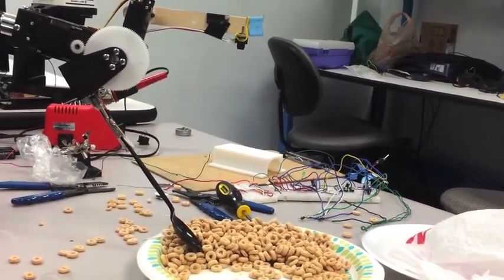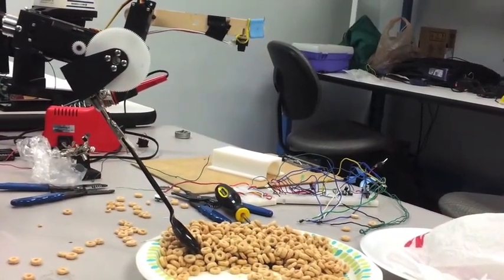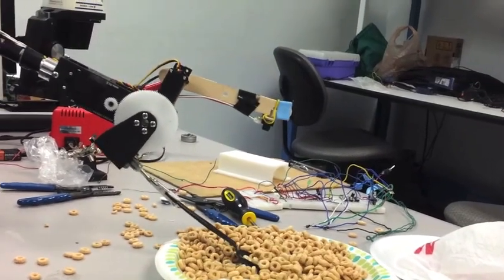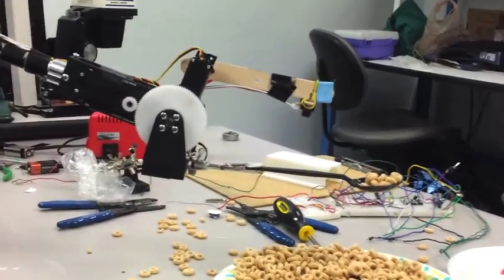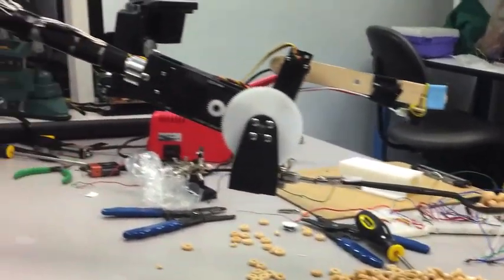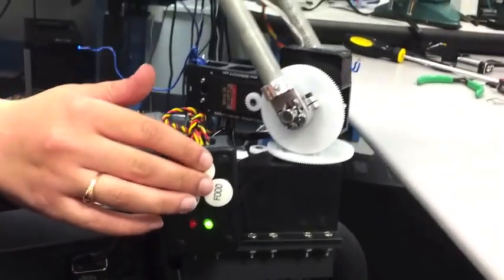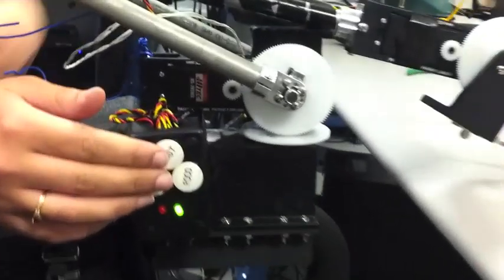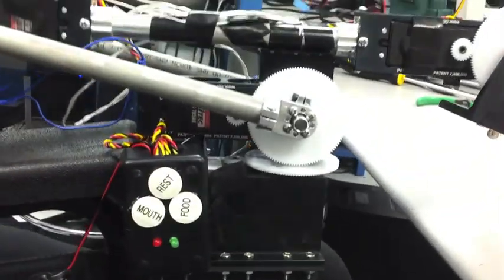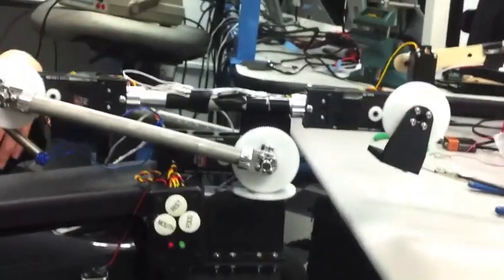It bounces back to where it left off, and if it doesn't find food in the original position, it continues searching. Once it finds food, it resumes. Once the user is done eating, he can send it to rest at any time during the process — for example, if he wants to stop for a moment to do something else.